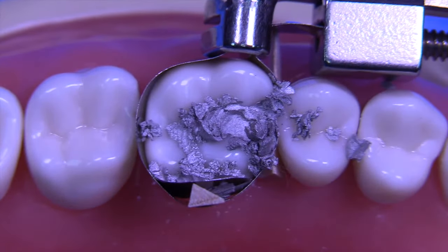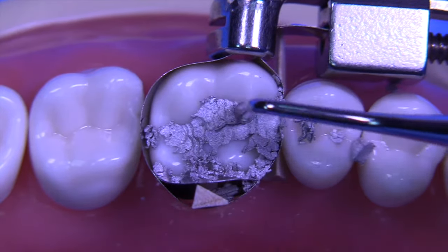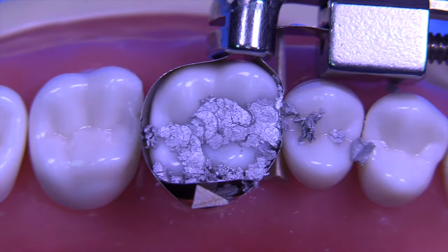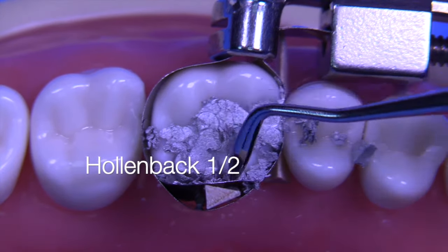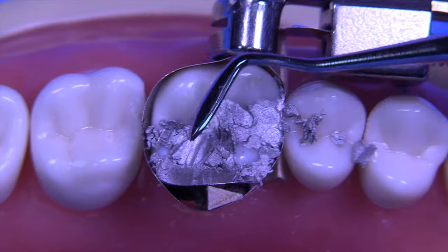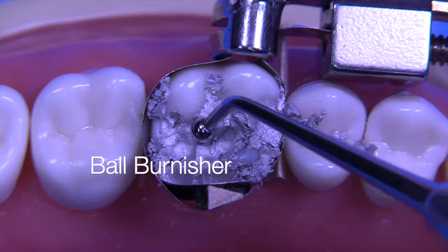We continue to fill with this admixed amalgam made by Kerr — it's called Contour. I like this amalgam because it gives us plenty of working time, usually around 12 to 15 minutes, which is nice because it allows you to develop really good anatomy. Once again, the Hollenbeck carver on the lingual to condense in an area where we cannot get a small condenser.